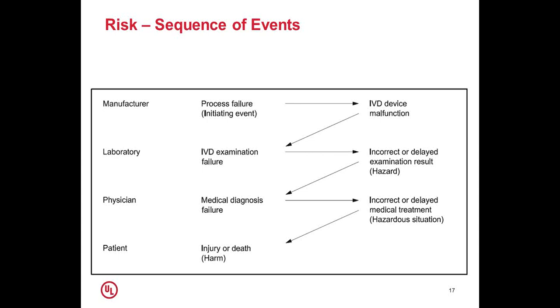You can see nowadays the glucose meters which have started coming in homes actually do not have any buttons on them. You just need to put the test strip in the intended way, and the test starts showing the reading. What is the significance of this? The user interface is reduced to a minimum, by which we are attaining less user error. At the same time, software malfunction is reduced.